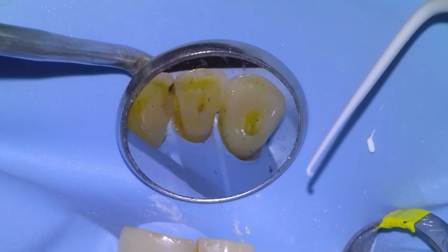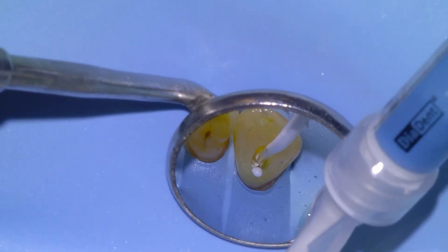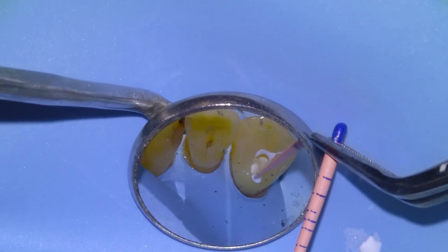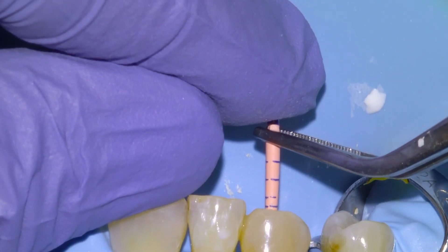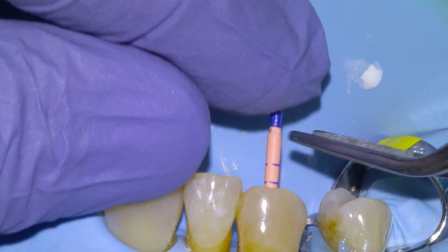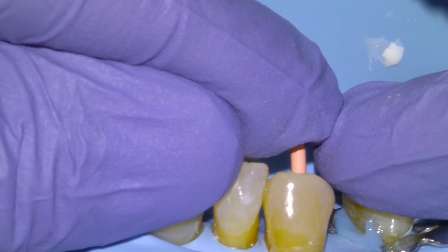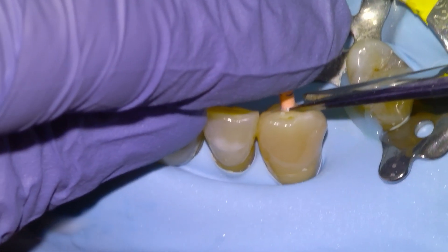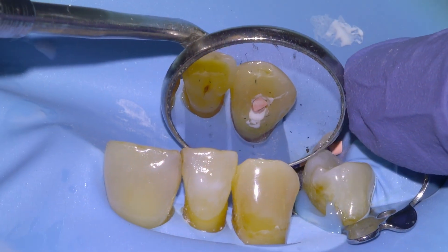We're going to begin obturating with a bioceramic sealer using single-cone hydraulic condensation obturation technique, which I think is the only logical way to obturate a tooth. We take the material down as apically as we can and then apply our master GP cone, tamping it up and down a few times to verify that the sealer material reaches the apex. We place it down to length. Someone on Dentaltown suggested taking an x-ray after placing the cone before filling up, which I agree is the right approach, so I took a PA after seating the cone and we were happy with it.